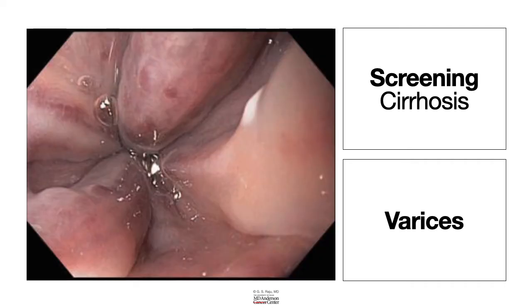Next, if you have a patient with cirrhosis of the liver and you want to screen that patient for varices, when you perform endoscopy, you will see dilated veins in the lower esophagus, and here you have varices marked by the arrow. We see at least 2 big varices at between 12 to 1 and between 6 to 7, and also a couple more varices on the other walls.